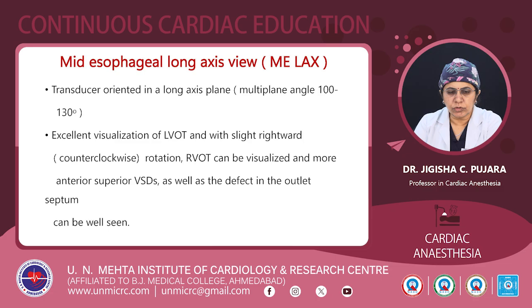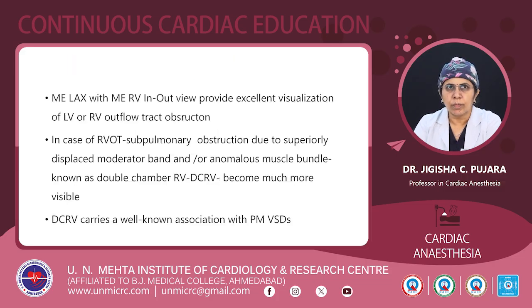Mid-esophageal long axis view is another important view for visualization of the outlet VSD, with the transducer oriented in a long axis plane, multiplane angle 100 to 130 degrees, and excellent visualization of the LVOT. With slight rightward counterclockwise rotation, the RVOT can be visualized, and more anterior superior VSDs as well as defects in the outlet septum can be well visualized in this view.